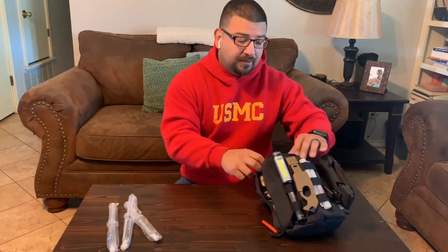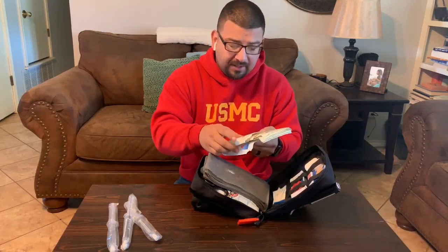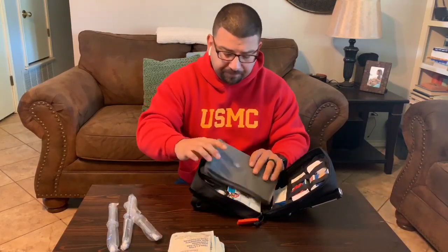Another thing that I have in here is just a bunch of bandages. These are different bandage sizes. Some of these have their own adhesive on them, some of them don't. Big old bandage there. Some gauze pads. And there's more gauze pads in here, but these are just on top if I need to get to them really quick. Obviously sitting right here, very easy to get to.